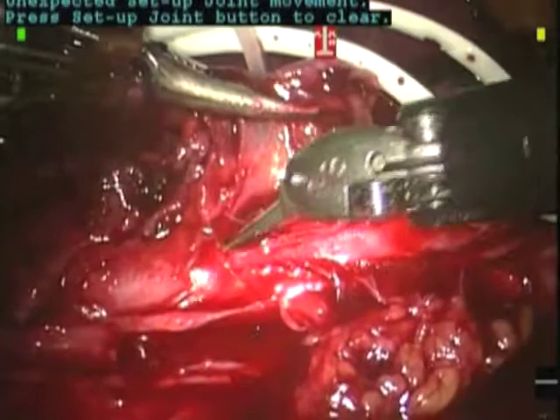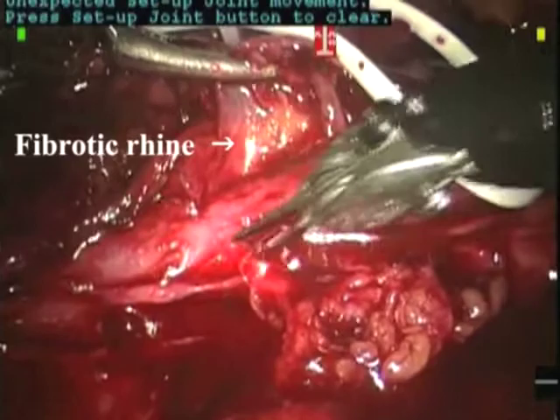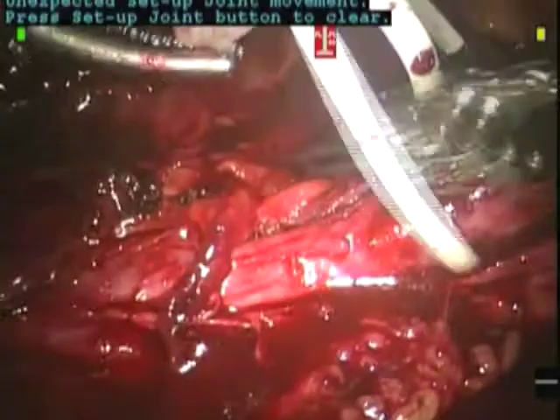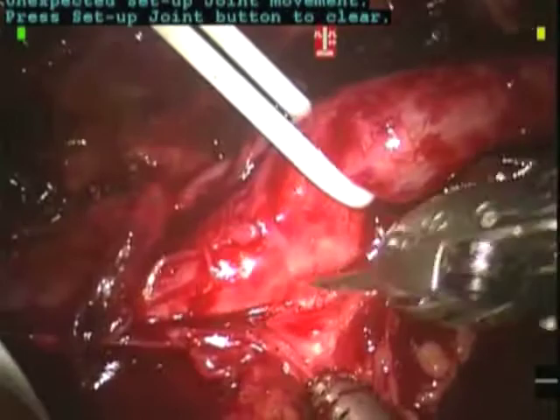Once the ureter has been identified, we then circumferentially release the ureter out of this fibrotic mass. This dissection is always performed sharply with a combination of the potts scissors and some blunt dissection. We always avoid using electrocautery to prevent further ischemia of the ureter.